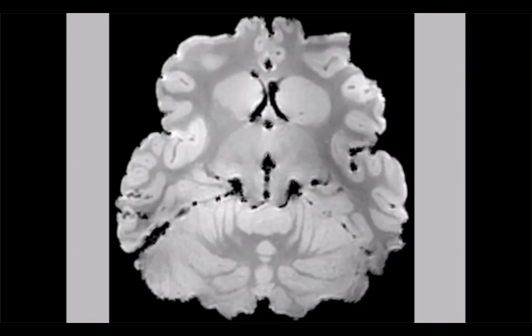You see, this is a big one. Here's a big one, big artifact. Is it at an air interface? That's right. Air tissue interface. So these are susceptibility artifacts because of air tissue interface. Absolutely. So it creates a very strong T2 star effect very close. And then as you move further away, the T2 star effect is diminished, but there is a little bit of shift. Remember, the effect of off resonance is either T2 star, there's some shift that is associated, and that shift results in some brightening because when you have signal that is moving and it moves on top of other signal, then you get this brightening effect called pileup. And that's why it's a little bit brighter on the bottom.